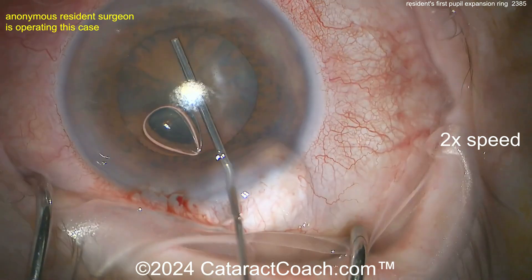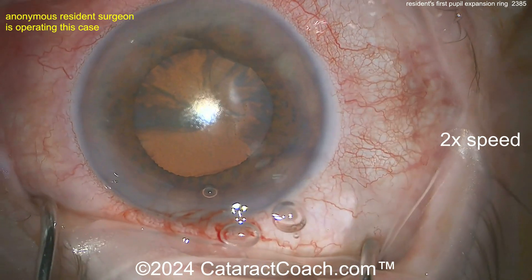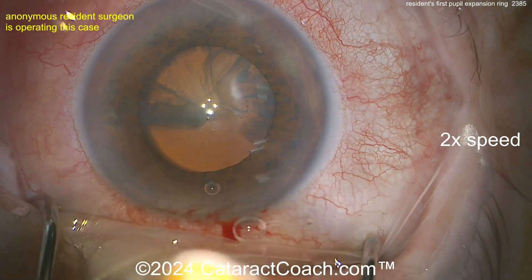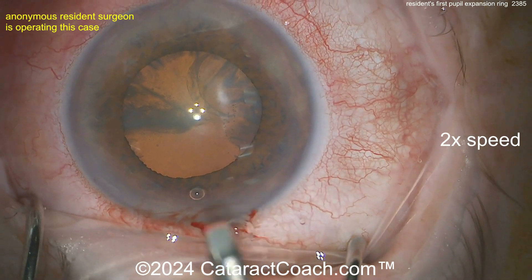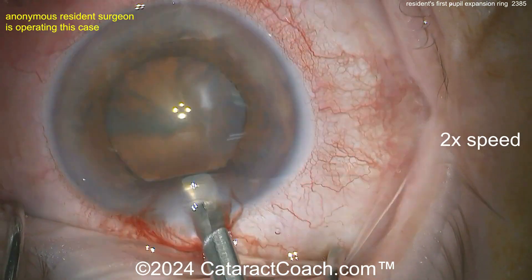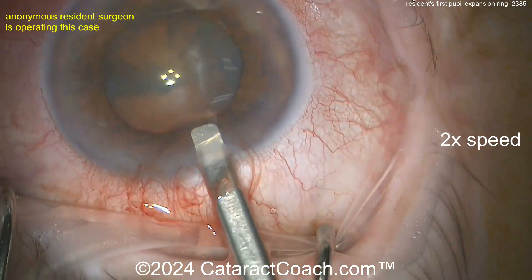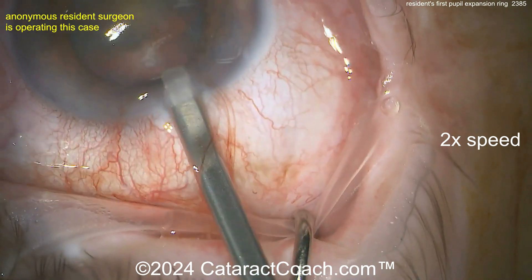In this case the patient has some Flomax/tamsulosin floppy iris syndrome. The resident surgeon is putting small aliquots of viscoelastic underneath the iris in the areas where the scrolls of the pupil expansion ring are going to be placed. There's the expansion ring being loaded up — these come in two different sizes, make sure you get the size that you want. I like to lift up the incision before putting this in, using the chopper in the other hand.